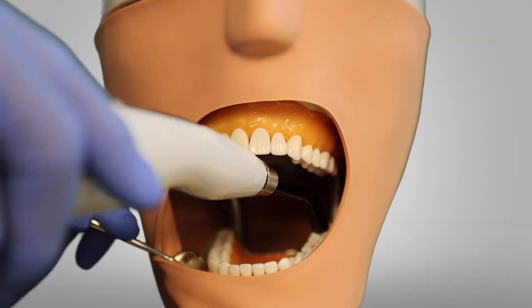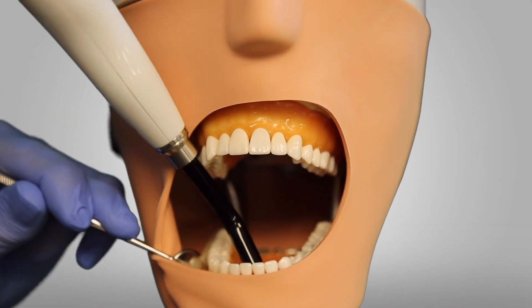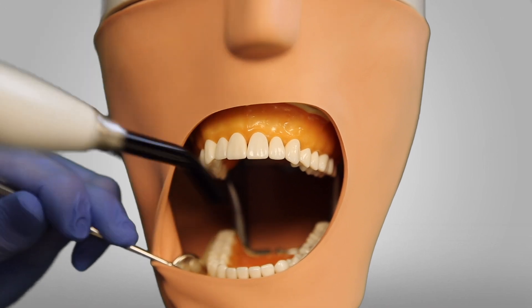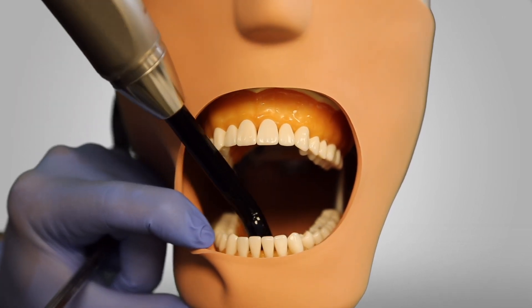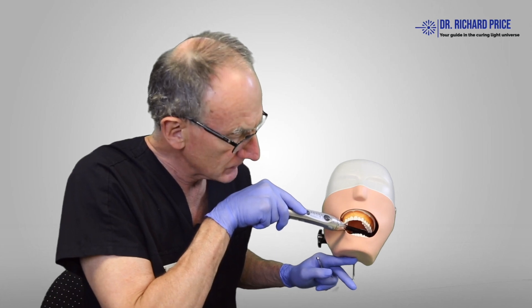Let's try a different light here. We can see how wide the patient has to open to access the back teeth and the lower incisors. Now we'll switch to a different light, and here we can see that with a lower profile head the patient doesn't have to open up nearly as much for us to access that last restoration.